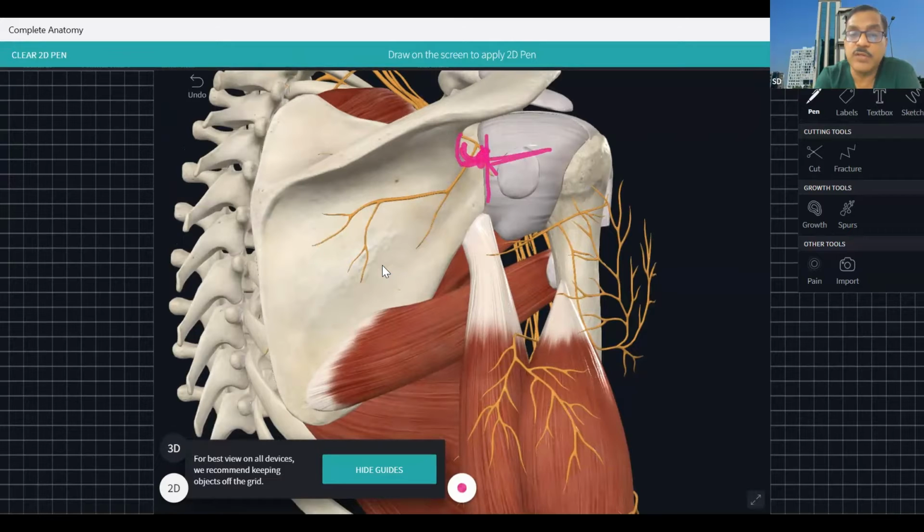So if you are holding the probe here, and if we are able to see this notch, on the lateral aspect of this notch we can block it so that the muscular branch will not be damaged. Muscular branch will be saved. So suprascapular nerve block in the suprascapular notch is nowadays obsolete. We don't block the suprascapular nerve at the suprascapular notch. We block the articular branch of the suprascapular nerve at the spinoglenoid notch.